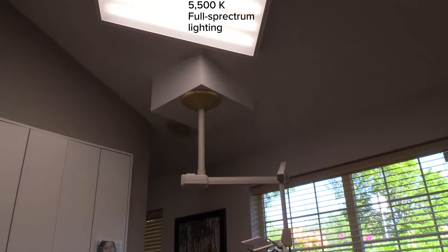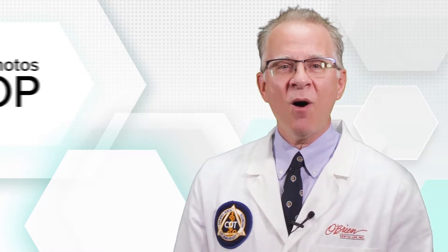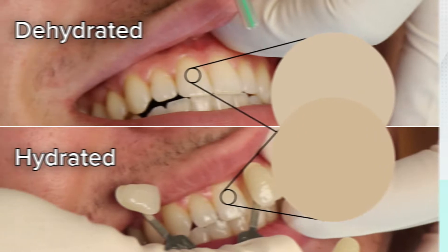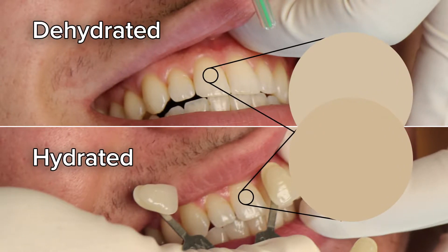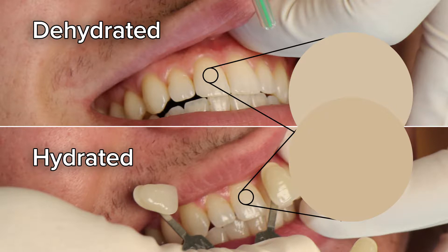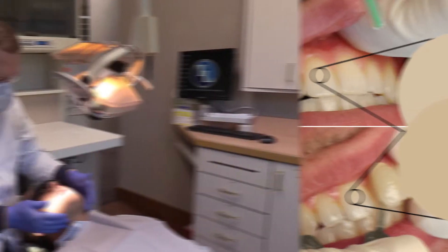Installation of full spectrum lighting where the shades are taken is critical. And this next one often gets missed: always take your shade pre-op when the teeth are fully hydrated. Teeth begin to dehydrate rapidly, and post-op teeth lose their translucency and appear lighter and brighter than they actually are. Shades taken post-op are seldom accurate, and how much shade will change once the teeth rehydrate is anyone's guess.